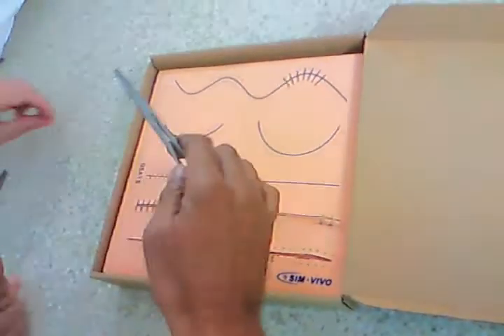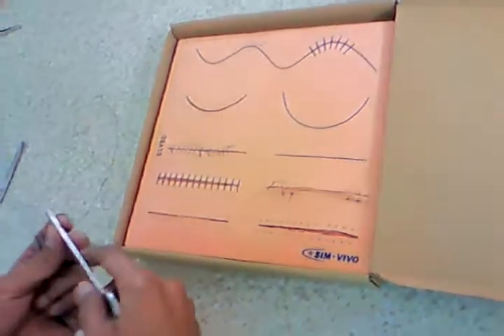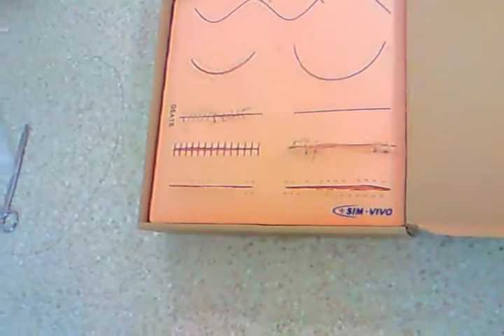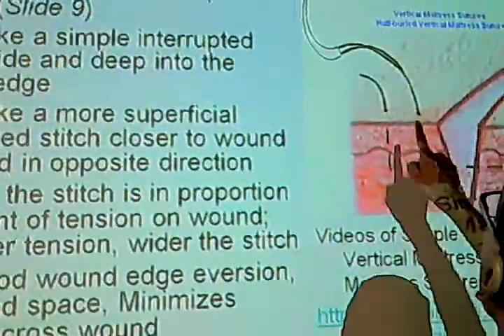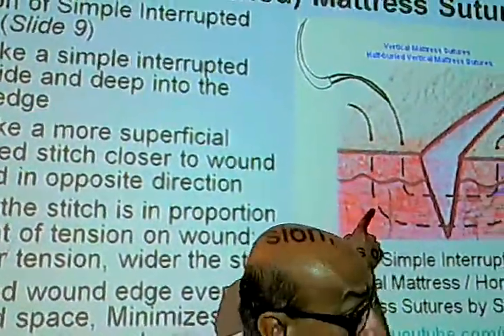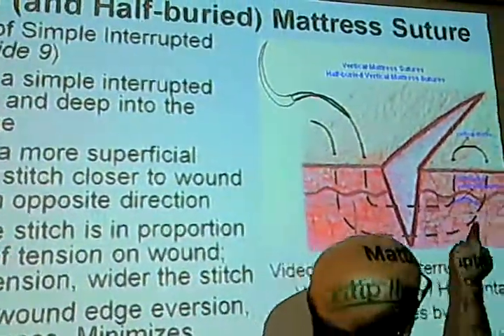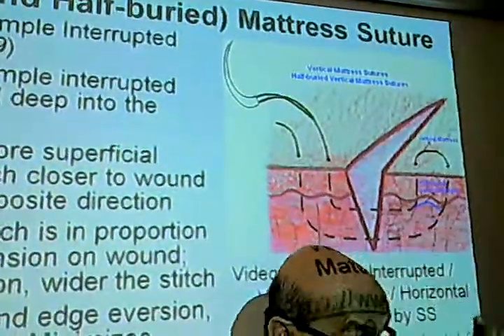The previous one was vertical mattress. Why did we call it vertical mattress? Because if you were to look at this wound and take a cross-section of this wound, as you can see in this, this is a cross-section of that wound. Why was it called vertical mattress? Because the first bite was deep, if you notice here. I'm just telling you the difference. Then it went deep, deep and came out far. So far, far.